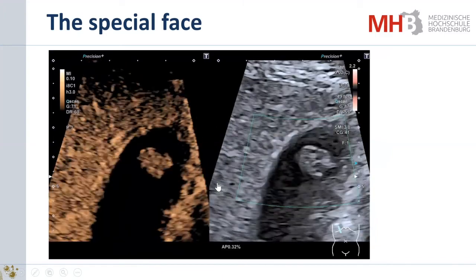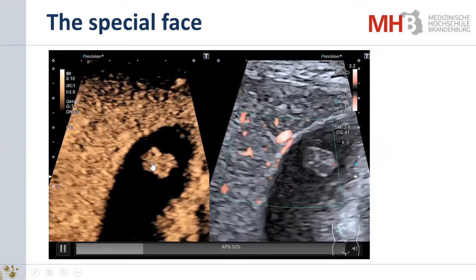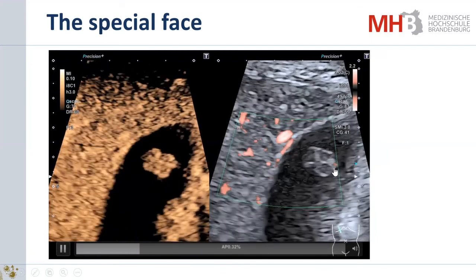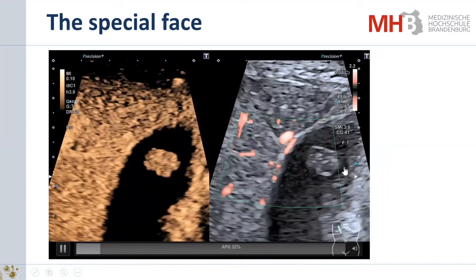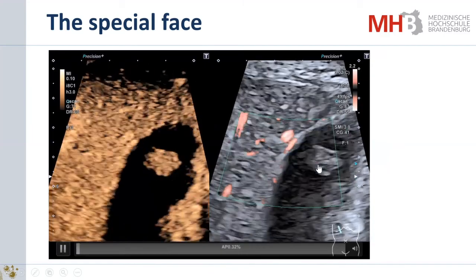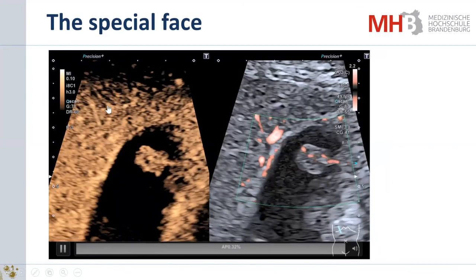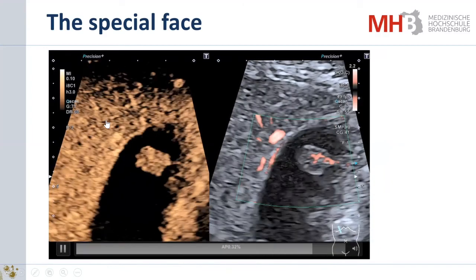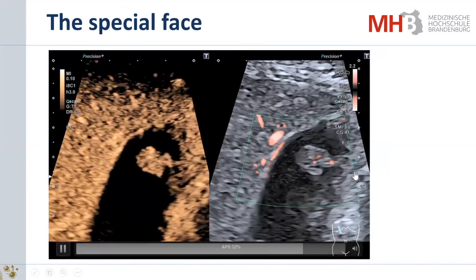And I can show you that we can show very nicely with a combined technology of contrast-enhanced ultrasound and slow flow Doppler that in this stalk there's a small vessel which divides into branches, and this polyp has the same vascularity, the same contrast enhancement with ultrasound contrast agent as the liver parenchyma.